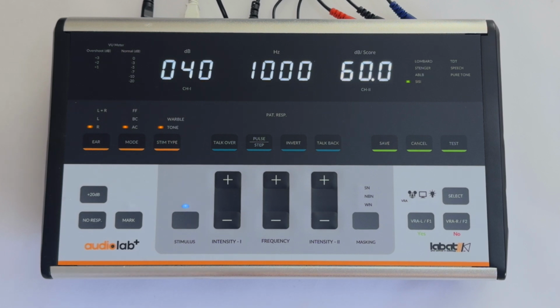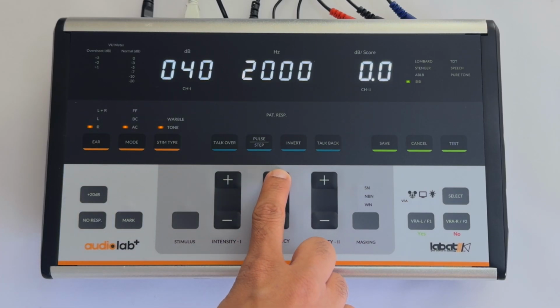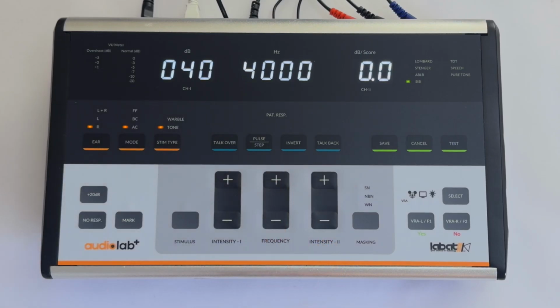Press the stimulus key to stop the test. Use the mark key to mark the final SISI score. If further evaluation is needed, the clinician can perform the same procedure at 2000, 3000, and 4000 Hz for accurate assessment. Press Save and then press Yes to save the test results.